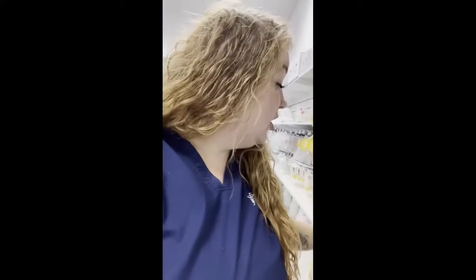So I encourage you, if you're a mom, you just gave birth and you're about to come in for your resupply items, please use your nipple ruler first, figure out what size is best for you, and then when you come in, let us know what size you want your flanges, because you do get a set of flanges covered in your resupply items, and I really want them to be the right size for you.